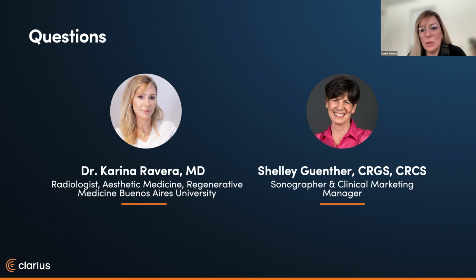Another doctor, Dr. Velma, asked, when do you use color Doppler versus power Doppler? Power Doppler is better for very little vessels or slow velocity vessels. And for large vessels, color Doppler is better. But you can use both of them in facial structures.